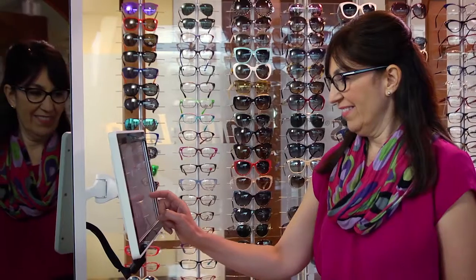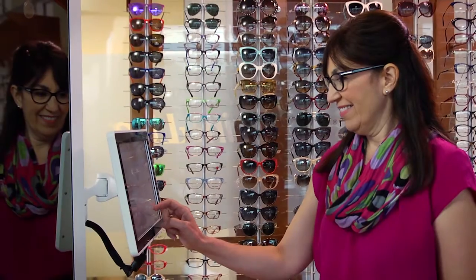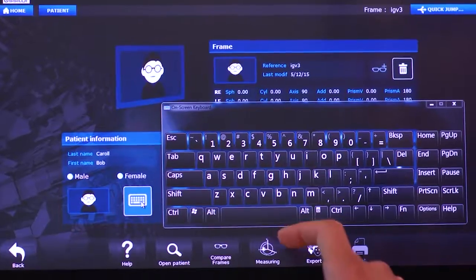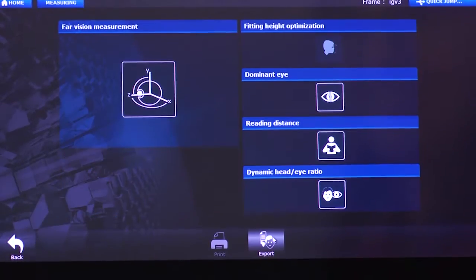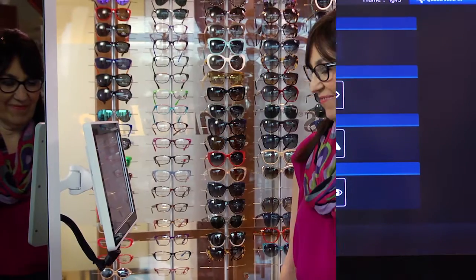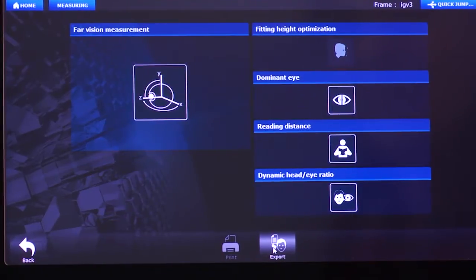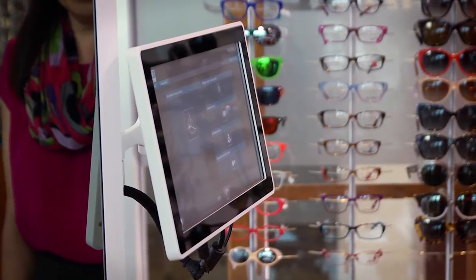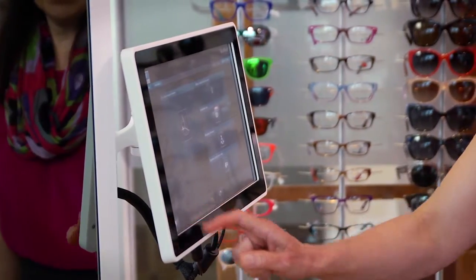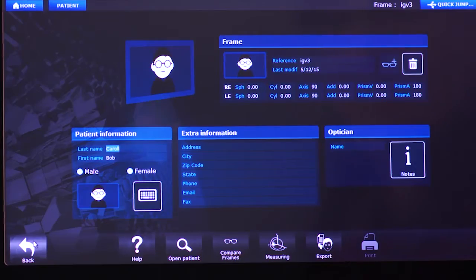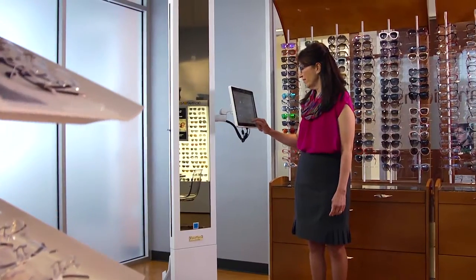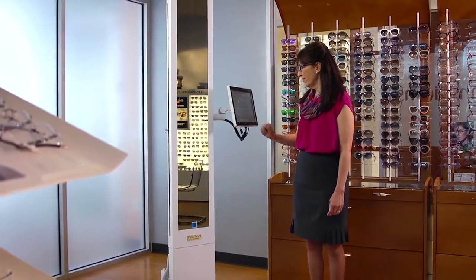Select the measuring icon at the bottom of the screen to begin measurements. The VisiOffice 2 touchscreen is pressure rather than heat sensitive, so a firm tap or tapping with your nail gives the best results.